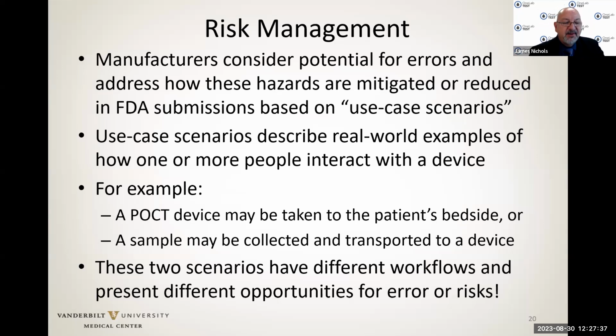When I'm at the patient's bedside, if I use the patient's barcode and I scan it, that specimen never leaves the room. But if I take that specimen, collect it, walk it down the hallway to where the device is, maybe it's even a blood gas analyzer, I have a risk now of interchanging that specimen, mixing it up with other specimens from other patients that may be in that utility room also being tested. So I now have a risk of mislabeling, and that risk is higher if I use the device down the hall than it is if I take it to the patient's bedside.